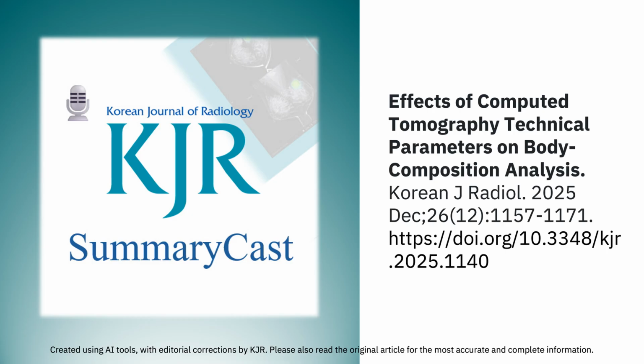It's uncertain. And the paper notes that histogram analysis of these low-dose scans reveals broader pixel distributions, which confirms that increased noise is a likely source of the variation. Figure 4 shows this visually. The histogram peak for the low mAs image is much wider and shorter than for the high mAs image. Interestingly, though, the area metrics in that specific example, SMA, VAT, SAT, were identical. So the area can be stable, but the density metric is fragile.